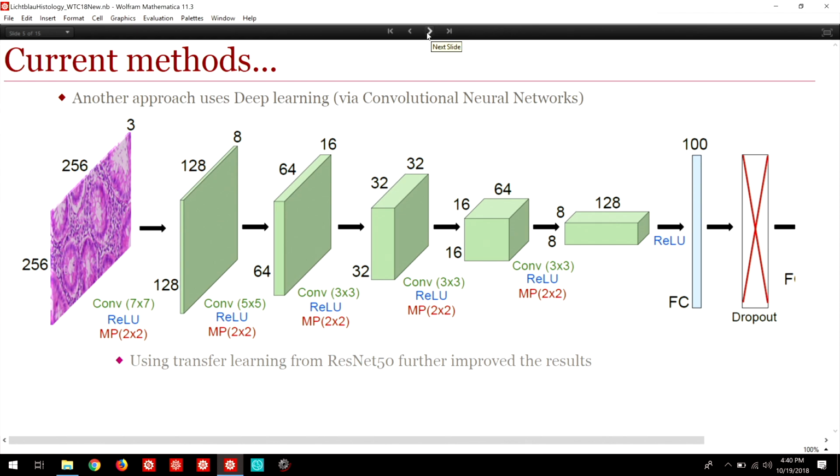I went over and did some feature selection then. I tried several options for feature selection there too. The one that proved to be the best was actually using a genetic algorithm to select, because, as I told you, my background is evolutionary computation. This is what I've been working on, so of course I had to use a genetic algorithm after all. And as a classifier, I tried several, and the support vector machine appeared to be the best choice.